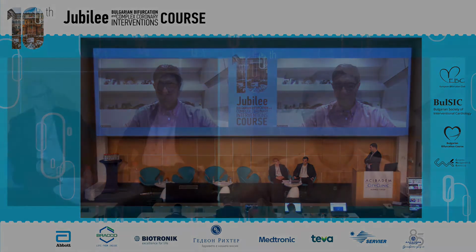And finally, after a good medical treatment, antiplatelet therapy and anticoagulation, when you do a follow-up, you have a more clear idea of what is needed and what the result is. And very often this thrombus disappeared, and it seems that further actions were unnecessary in this case. So this is something that we should all keep in mind when dealing with acute coronary syndromes and a big thrombus burden. Thanks a lot.